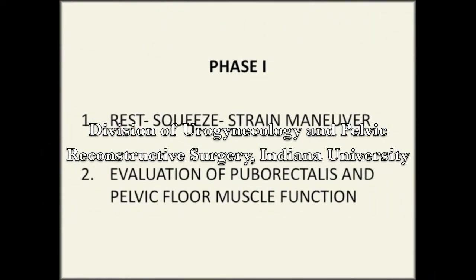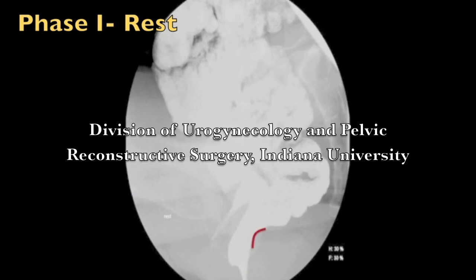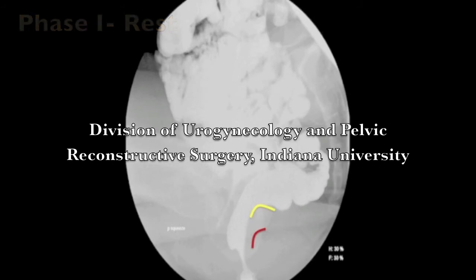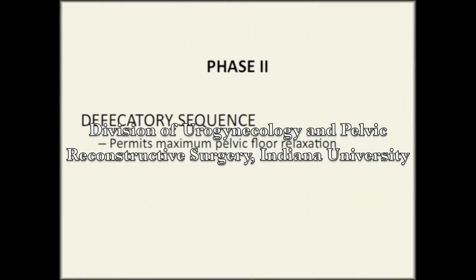During phase 1 of the DCP, the patient is asked to perform rest, squeeze, and strain maneuvers to evaluate prolapse and pelvic floor muscle function. The anorectal angle is demonstrated in red. Elevation of the anorectum, seen in yellow, demonstrates good pelvic floor muscle function. Prolapse is evaluated by asking the patient to bear down. During phase 2, the patient is asked to defecate, which permits maximum levator ani relaxation and demonstrates the maximum extent of prolapse.